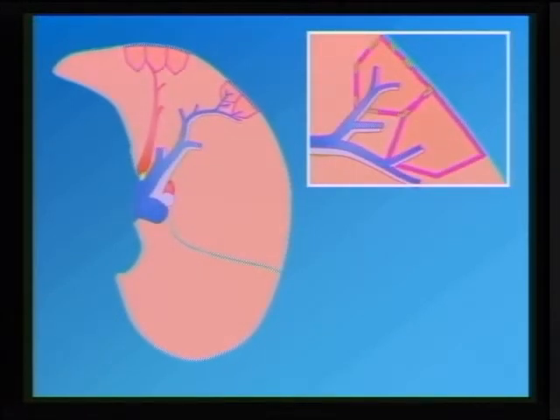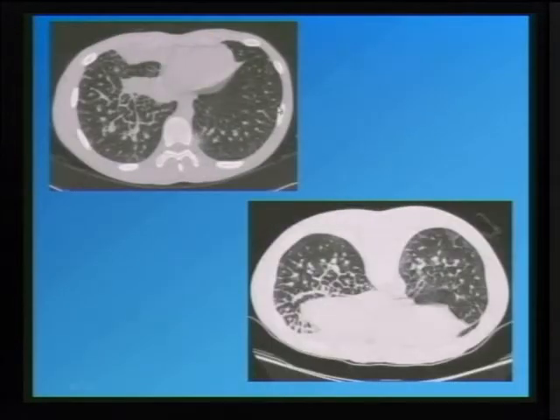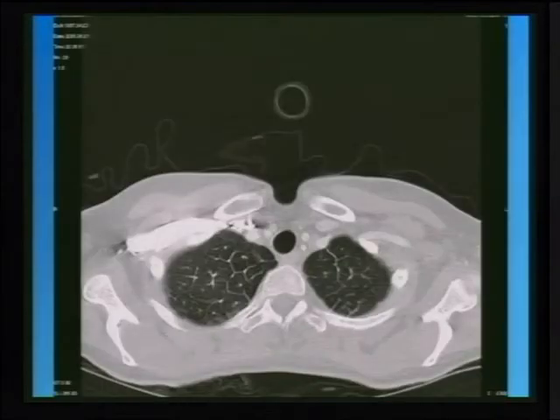So again, interlobular septal thickening manifested as the thickened interlobular septa outlining secondary pulmonary lobule, and also you know that the lymphatics do run within the interlobular septa. So lymphatic disease, whether it's lymphangiectasia or lymphangitic spread of tumor, can manifest as this thickened interlobular septa. So again, another patient with interstitial thickening due to dilated lymphatics, and then you can see that they do outline secondary pulmonary lobule. And again, the same thing where you can see that those are fixed phenomenon of thickened interlobular septa in this patient with lymphangiectasis.